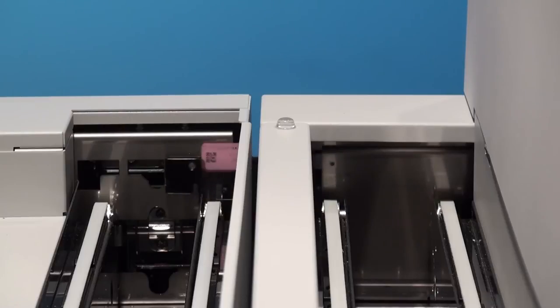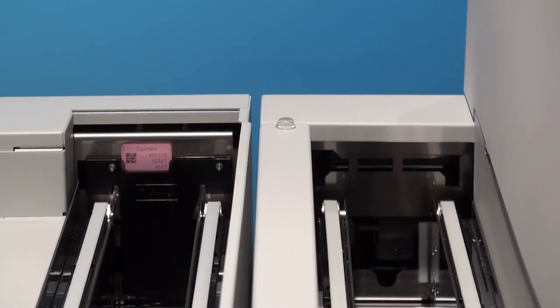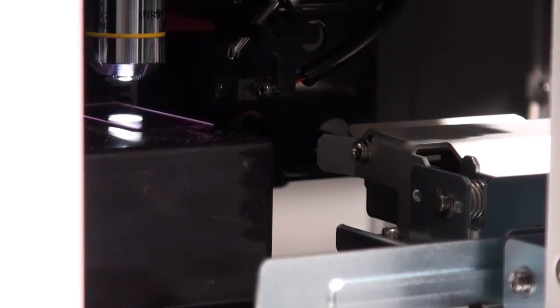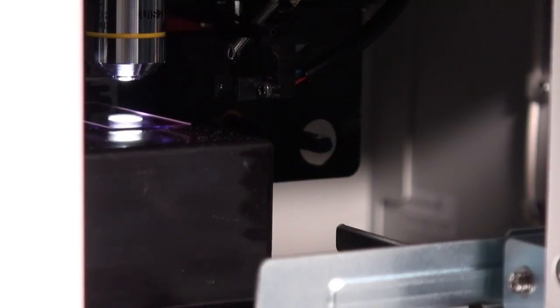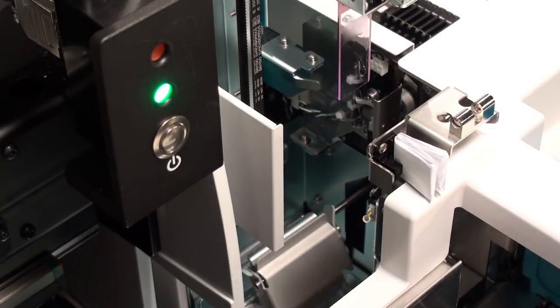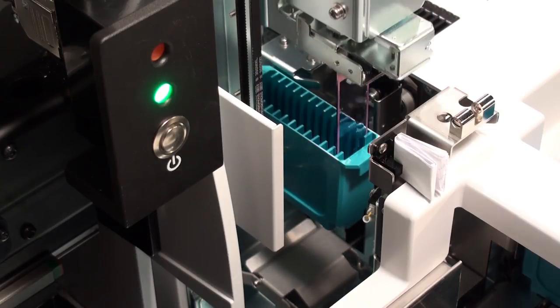Smears prepared on the SP10 are automatically transported into the DI60 Cell Image Analyzer by the connection feeder. The feeder will remove each slide from the SP drying cassette and shuttle the slide to the DI60 for processing. When digital processing is complete, the shuttle will bring the processed slide back and place it into a storage magazine on the system.